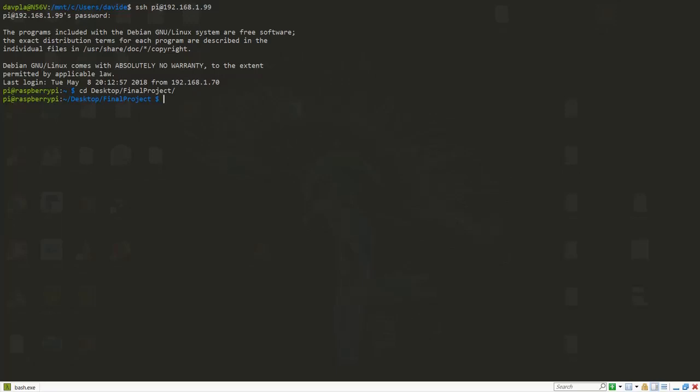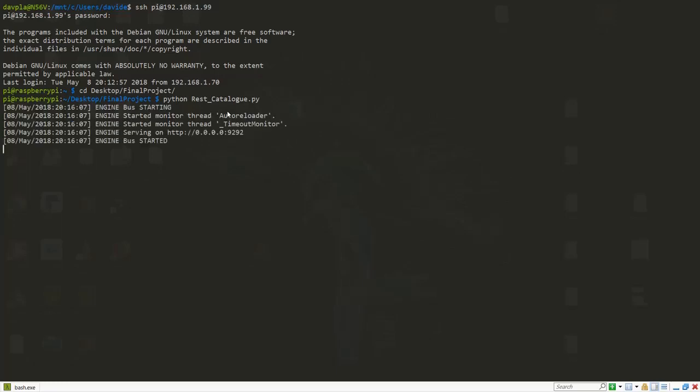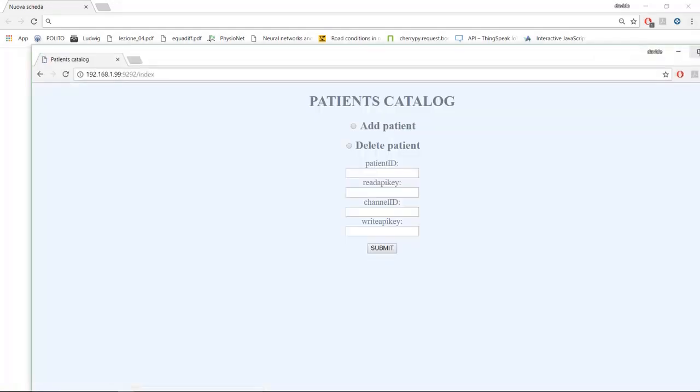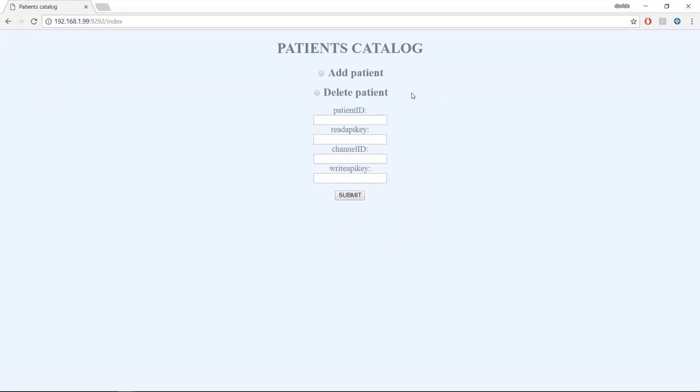We connected to Raspberry via SSH and now we run the script. Now we run the web service to add or delete patient. This is the interface to add or delete a patient. If I want to add a patient, I have to complete all the fields. In fact, if not all the fields are complete, a pop-up says that I have to complete them.